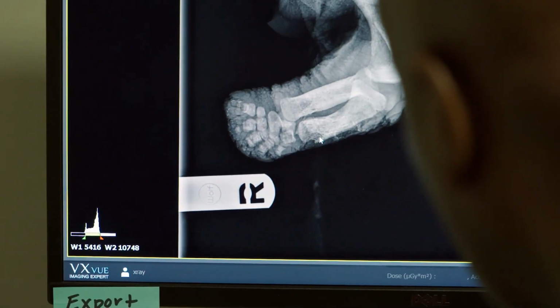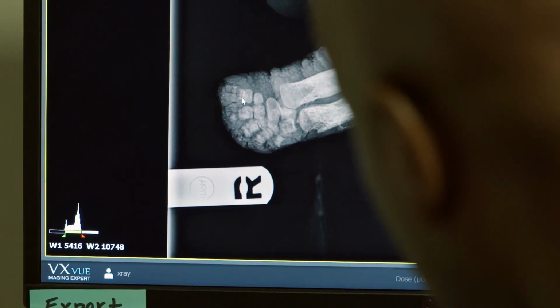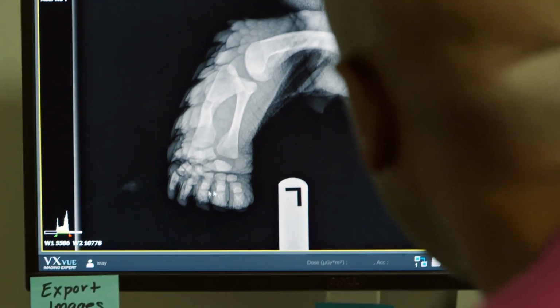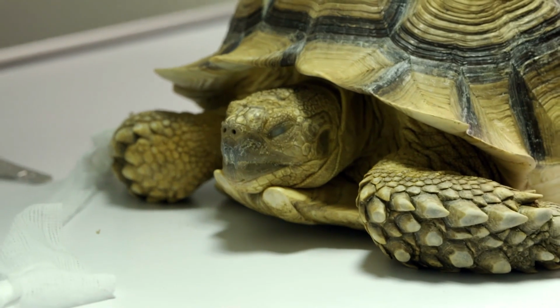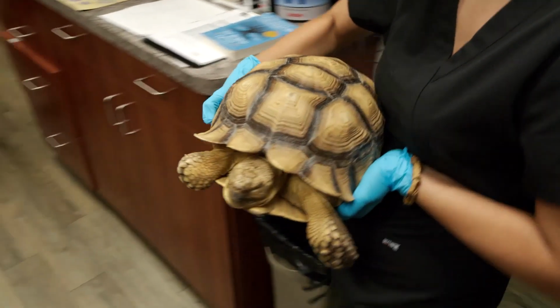Here's the problem. Definitely there's some lucency changes in the bone. Almost looks like a moth-eaten appearance. Yes, you can see that with cancer, but in this case, I just think it's infection that's gotten into the bone. And you can see the digits look like they're kind of eaten away. So if you look here compared to the normal leg, which is here, you can definitely see the difference. You can see all the digits coming up here, but then on this leg, they all look like they're cut off, and all that looks like it's been eaten away, and there's some infection and inflammation in that bone. She's not gonna get that back. So unfortunately, it looks like the next step is to amputate. I know it sounds kind of brutal, but in the end, she's gonna be happier, healthier, pain-free.